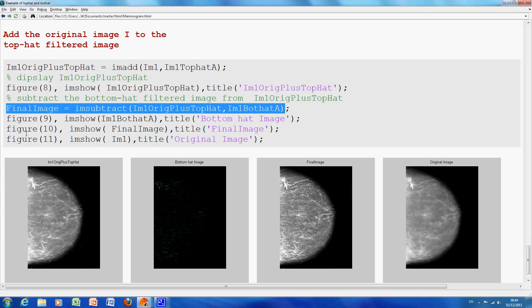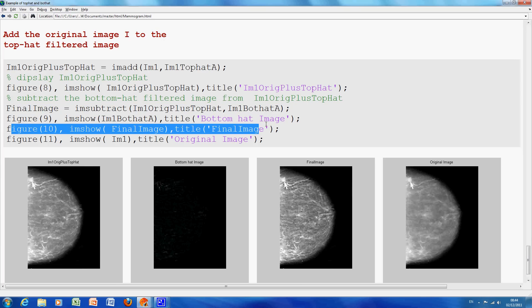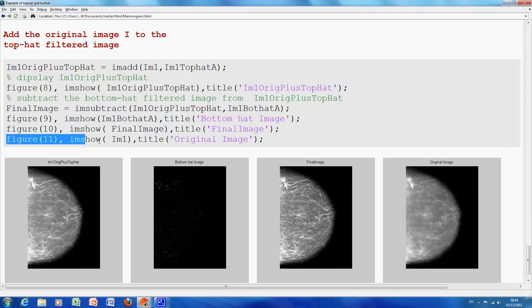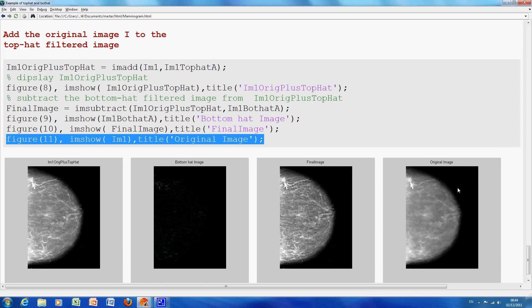So, figure ten, we show the final image, that's the second from the right here, and figure eleven, just to give you some idea of what we started off with, is the extreme one on the right here. Okay, so, hope that helps, thanks very much.